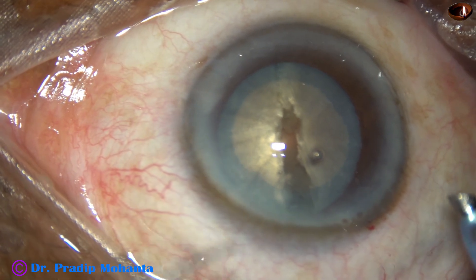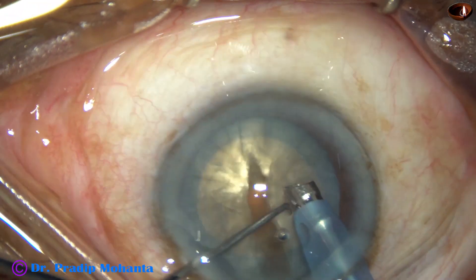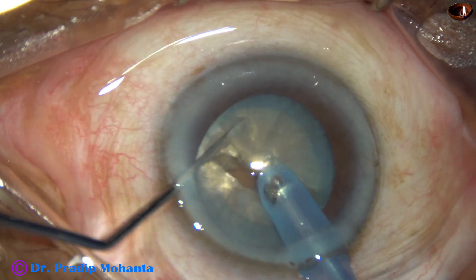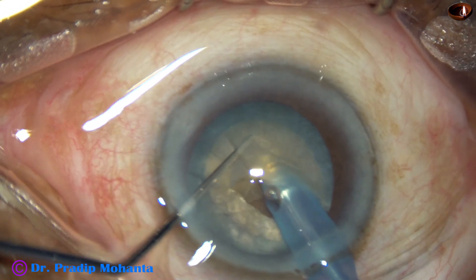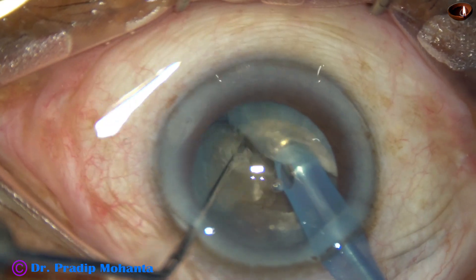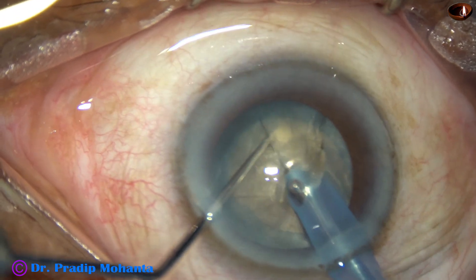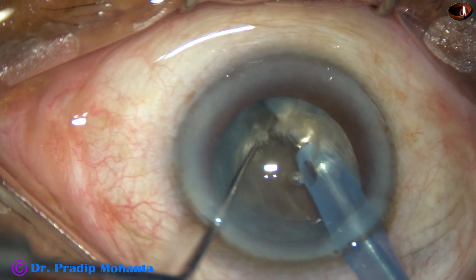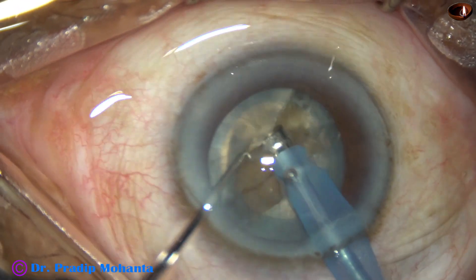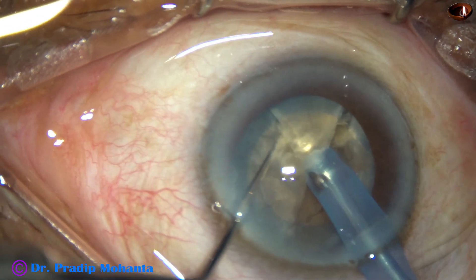I go again with the phaco needle and try the Submarine Chomp again, and this time I could get a nice crack. The nucleus has very leathery fibers.